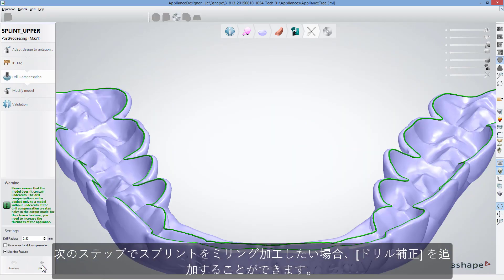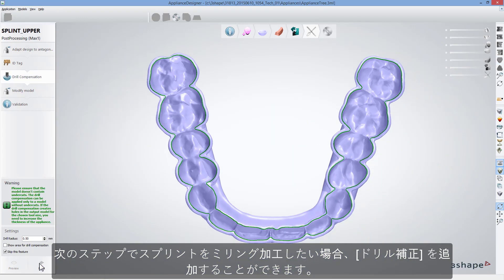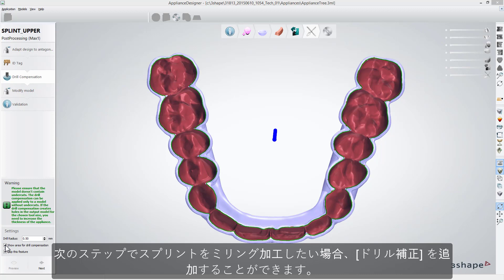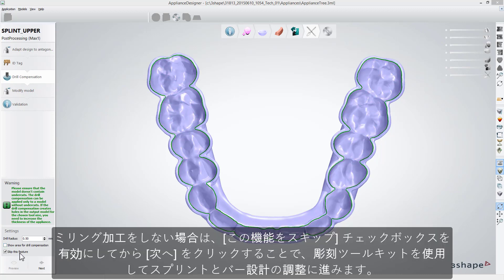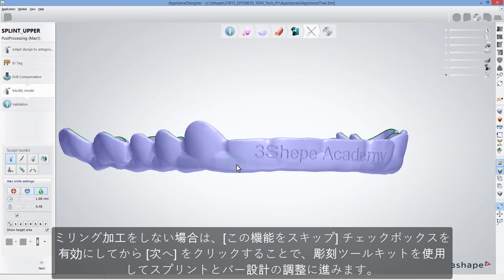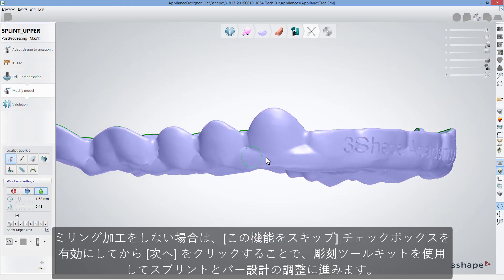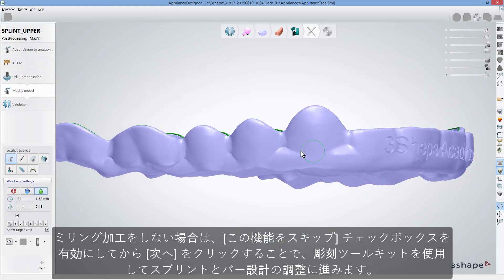If you are going to mill your splint at the next step, you can add Drill Compensation, but if you will not, select the box, skip this feature and click Next to move to adjusting your splint and bar design using Sculpt Toolkit.